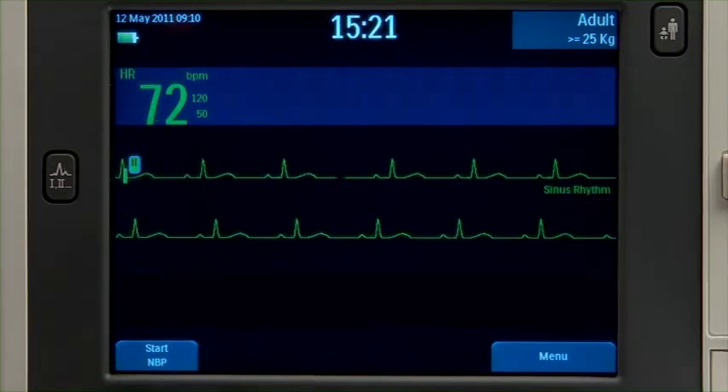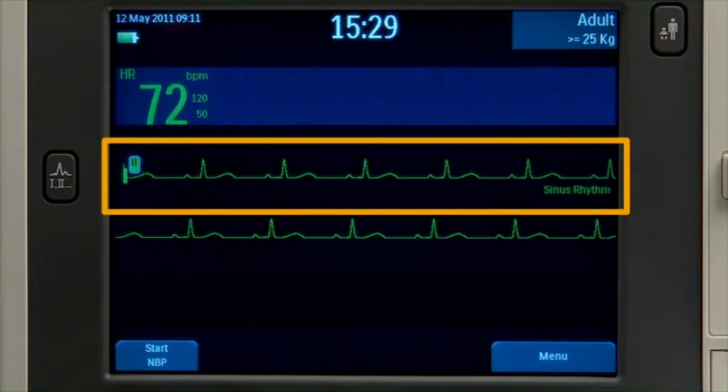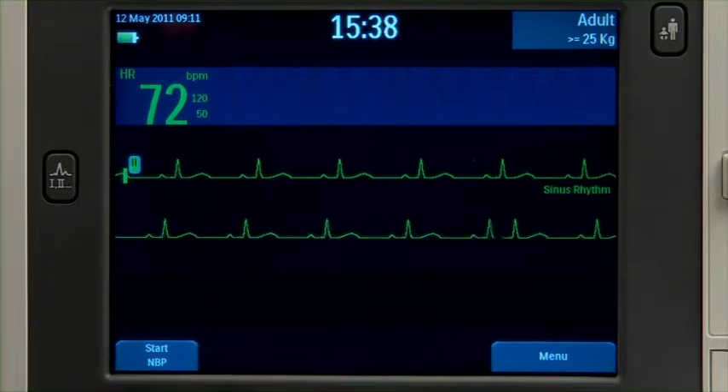The XL Plus is configured to populate each wave sector with a predetermined waveform. Wave sector 1 will only contain an ECG waveform, which is used by the arrhythmia, heart rate derivation, and AED analysis algorithms. If the configured source is not connected to the device when turned on, the first valid ECG source is displayed in wave sector 1.